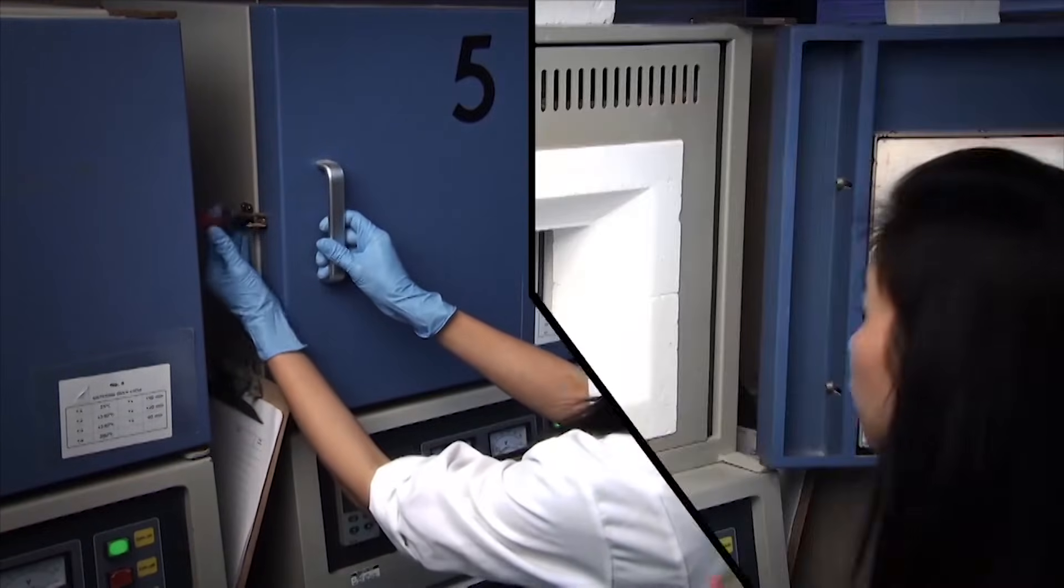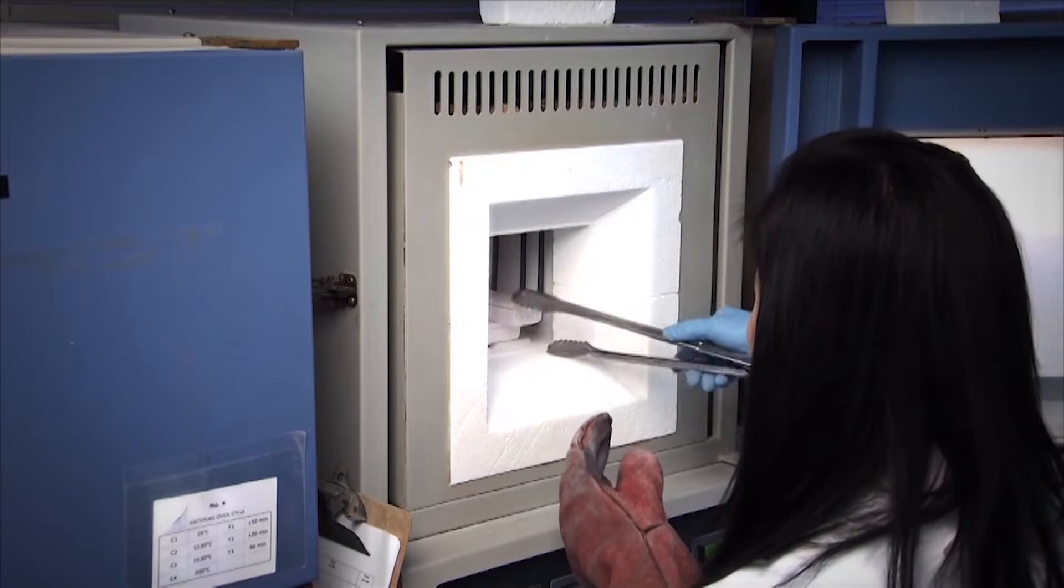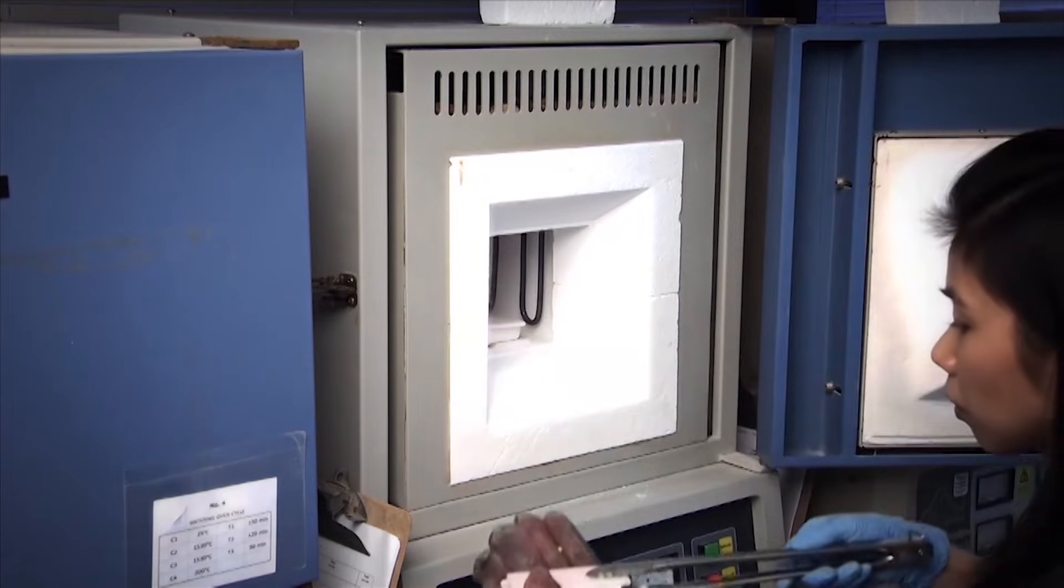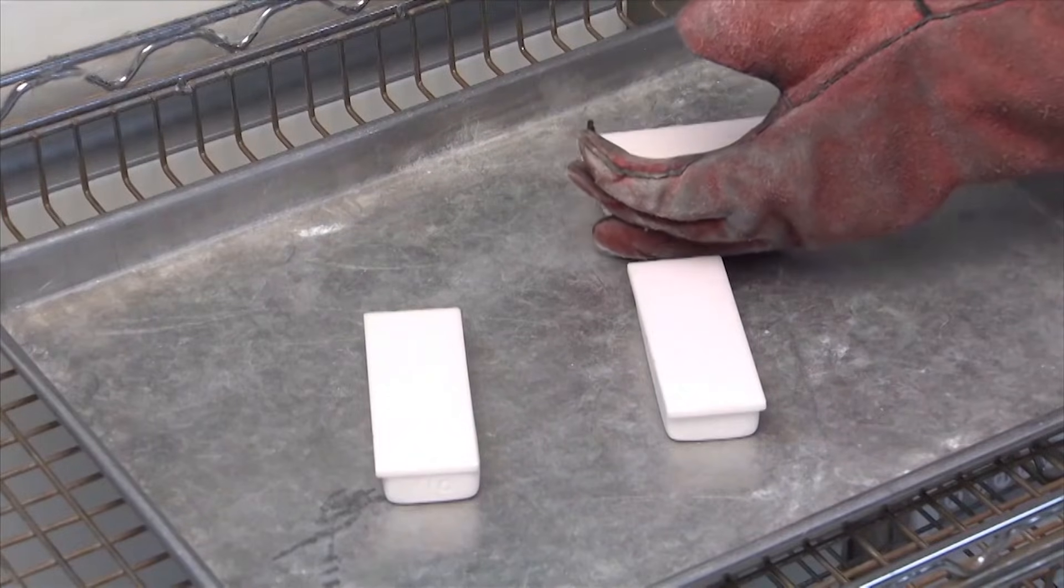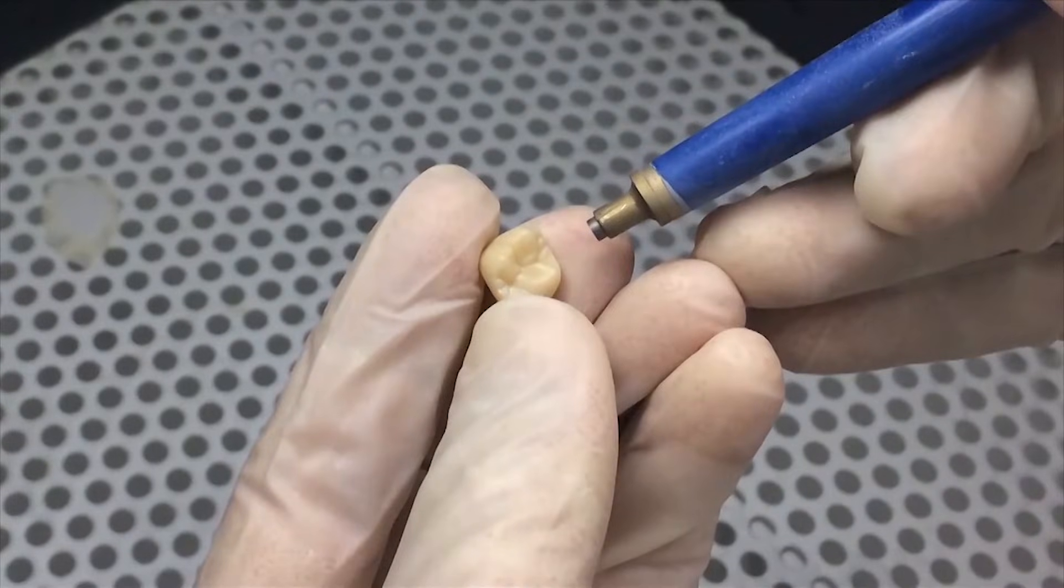So this way, as the crowns shrink during the nine hours sinter, those ball bearings roll underneath the crown. So the crown ends up being exactly the same shape. It just shrinks by 21 to 22% based on the exact enlargement factor for that particular block.